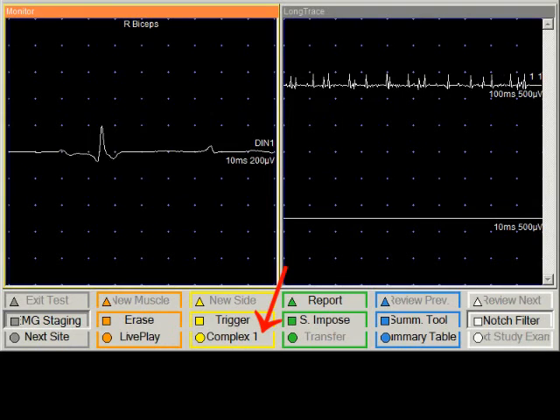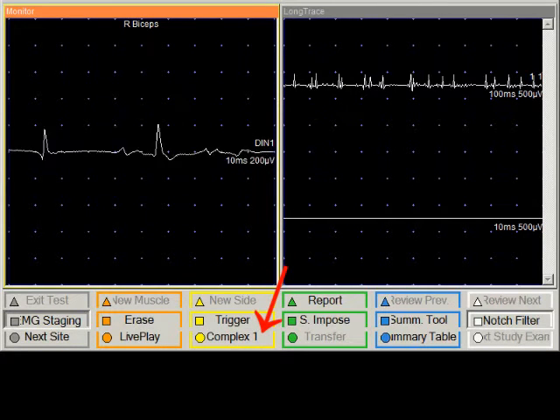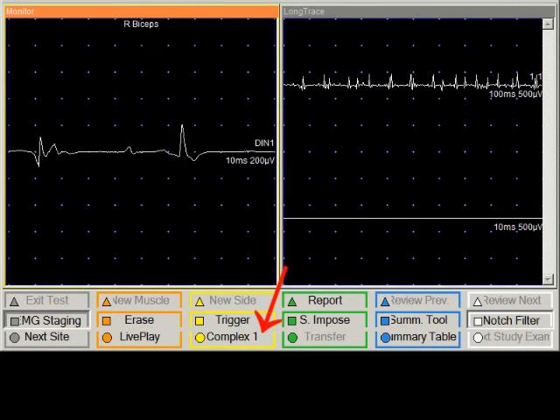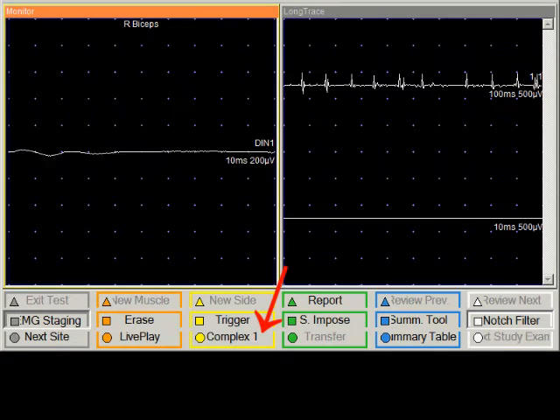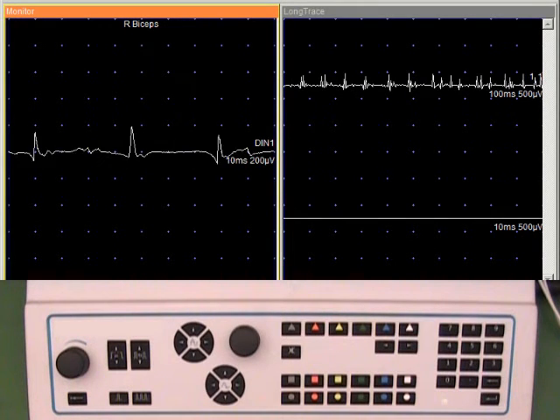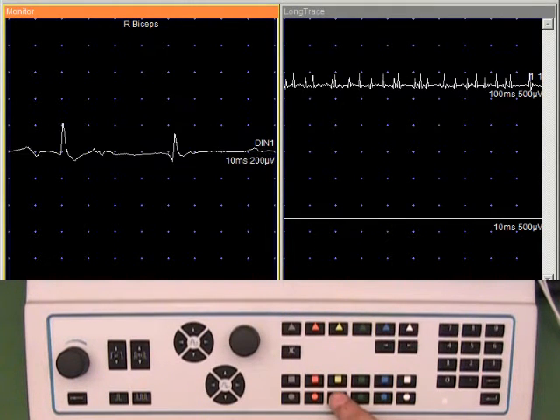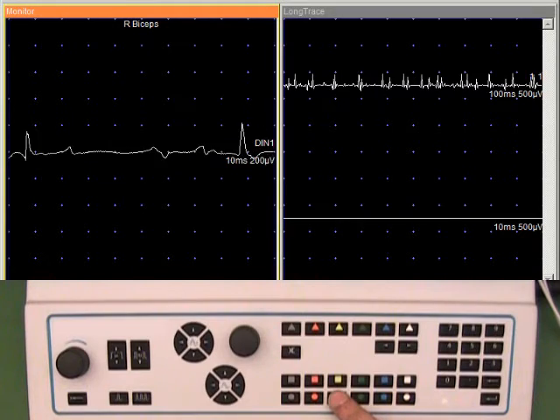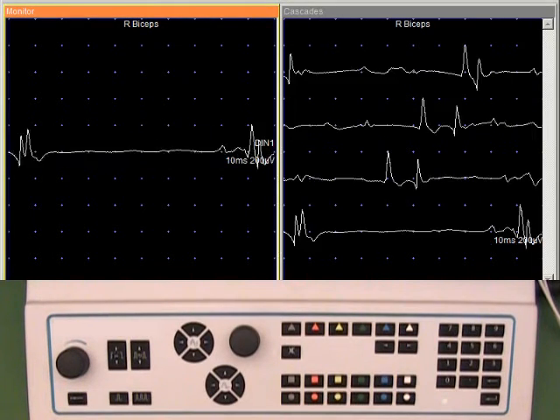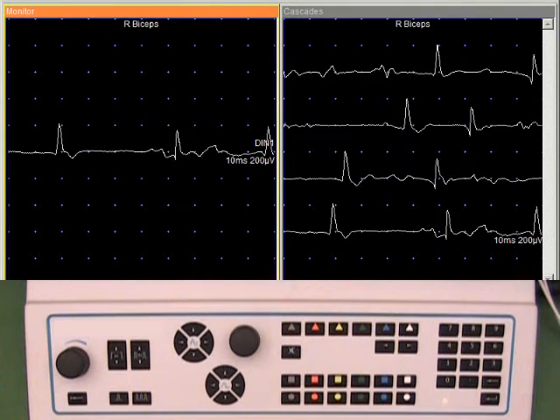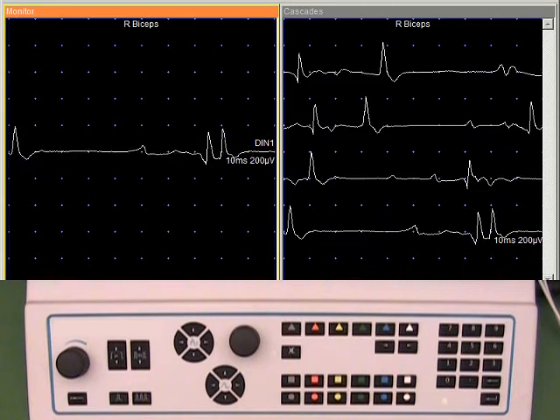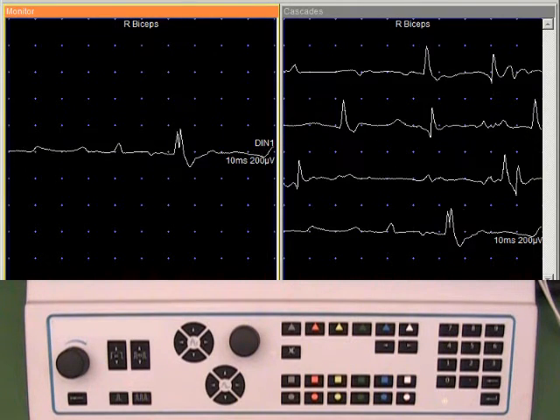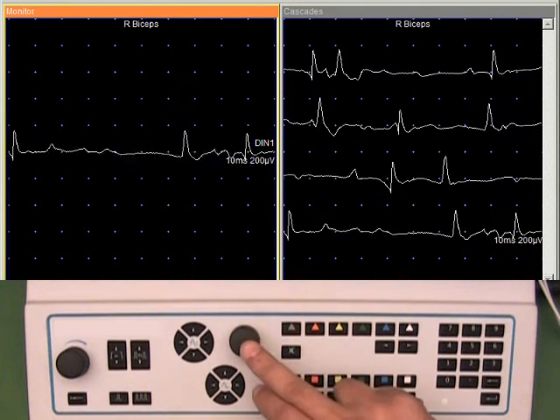We can look at the signals in a raster mode by using the complex one display. This is accessed by using the yellow circle key. We can stop collecting the data at any time by pushing the select knob.